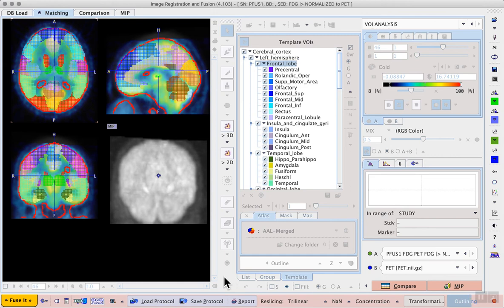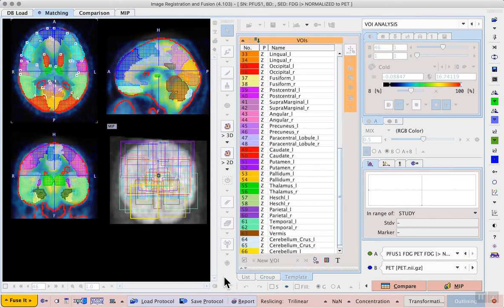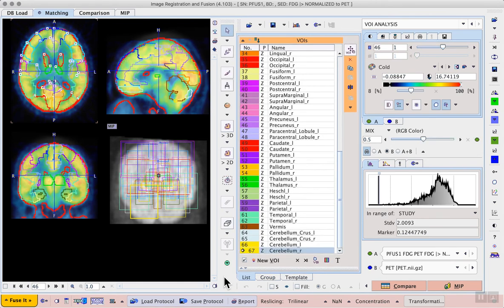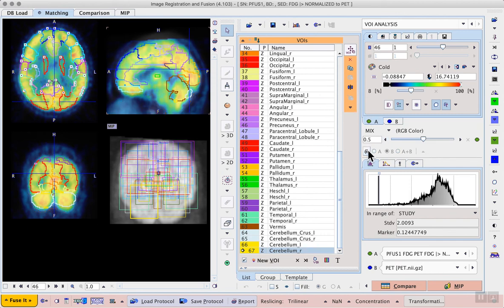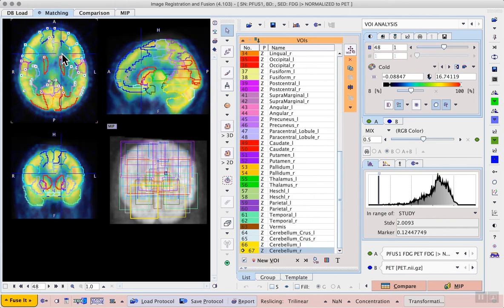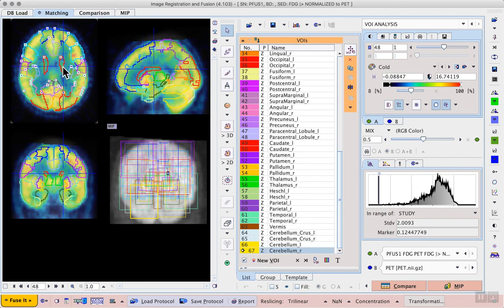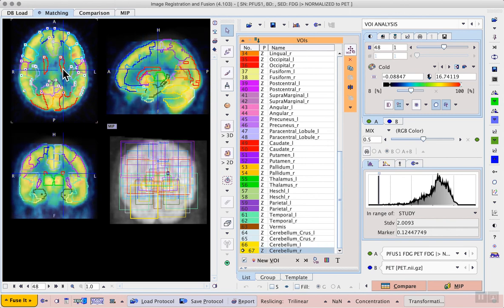Again depending on the speed of your computer this will take some seconds to a couple of minutes. And once it's complete again we can navigate within the image to inspect the overlap of those VOIs with our data. On the right hand side in the fusion controls I can turn off the red contour for the template and then I can explore the image to see how those VOIs correspond to the tracer uptake.